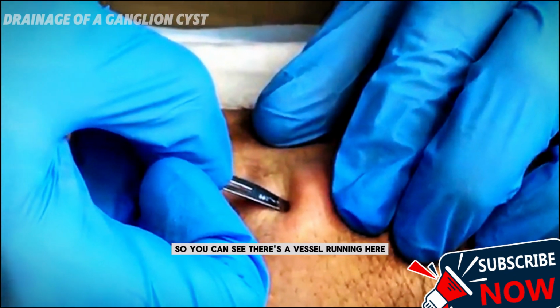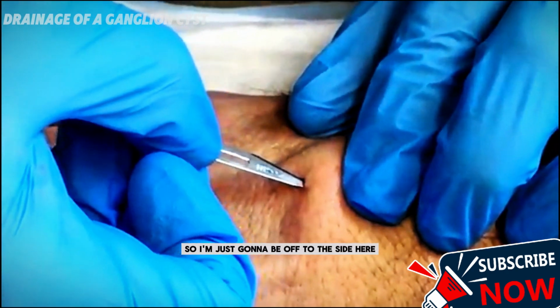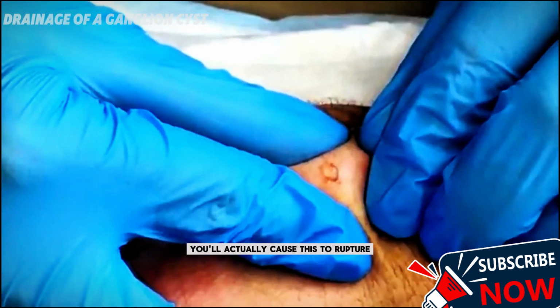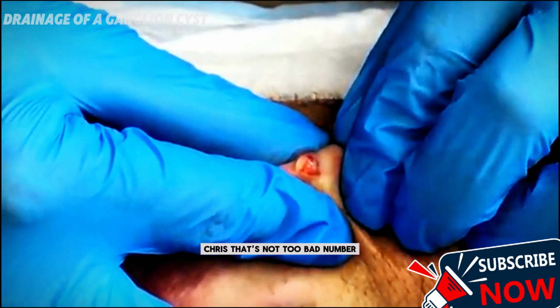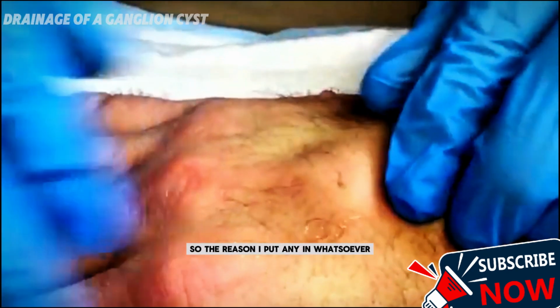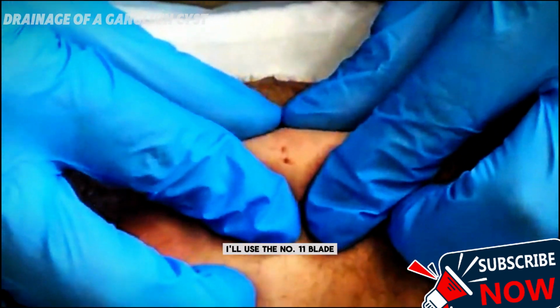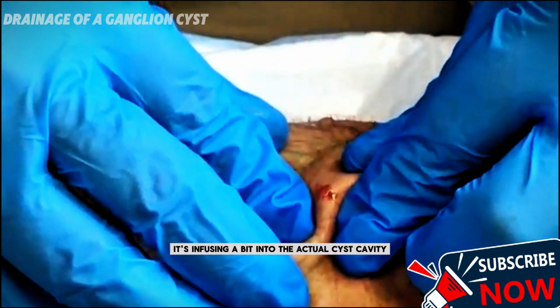So you can see there's a vessel running here. I'm just going to be off to the side here and put a puncture. A lot of times with ganglion cysts, you'll actually cause this to rupture just by putting a little bit of your freezing in. Chris, that's not too bad? The reason I put any in whatsoever is just because I'll usually drain this. And you'll see in a second, I'll use the number 11 blade. You can see it's infusing a bit into the actual cyst cavity.